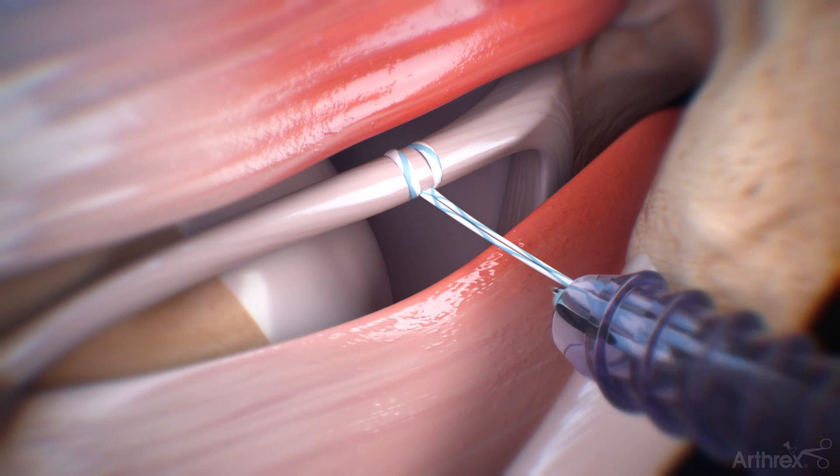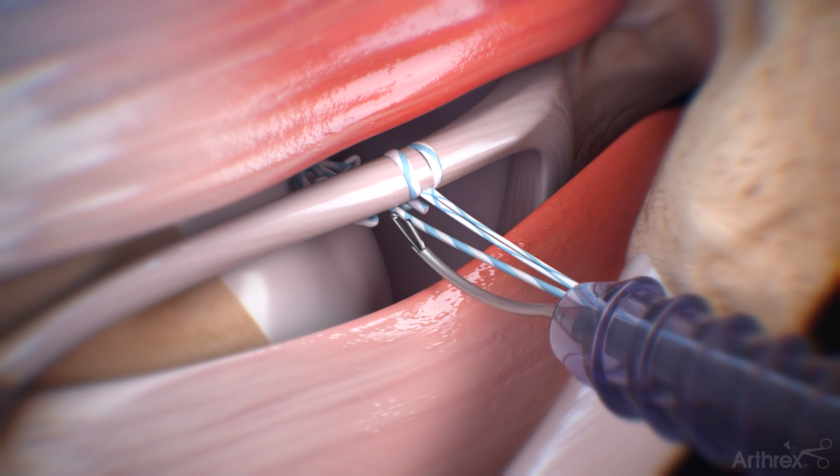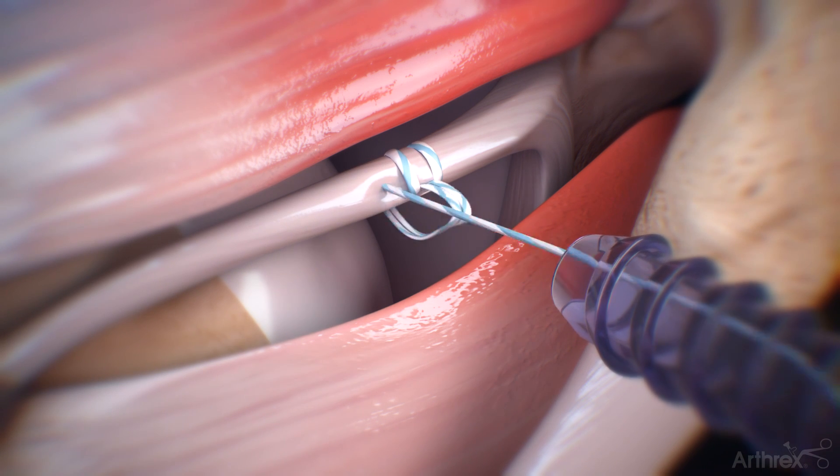Complete the LupinTac configuration by advancing a portion of the tail end of the suture under the biceps tendon. Insert the LupinTac swift stitch suture passer through the biceps tendon and retrieve the tail.